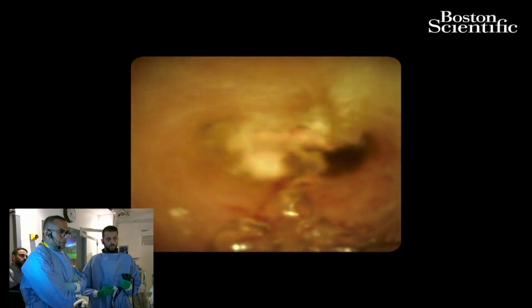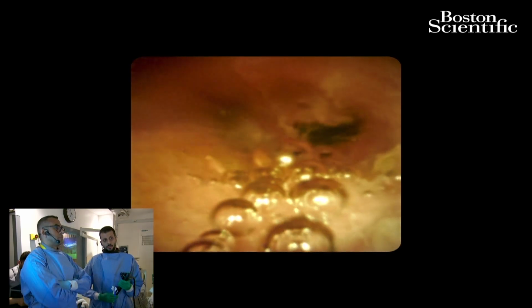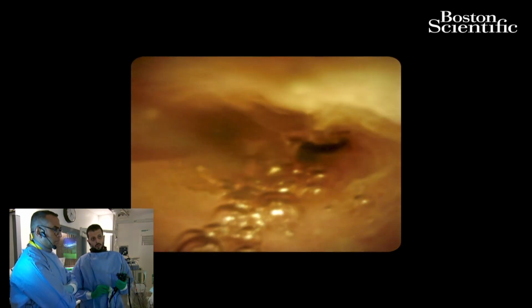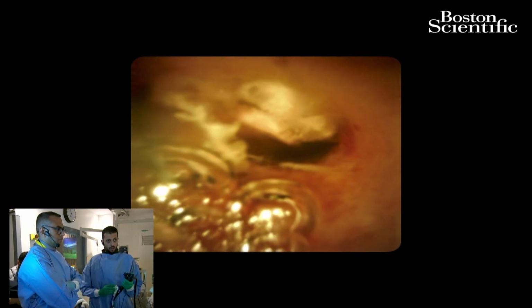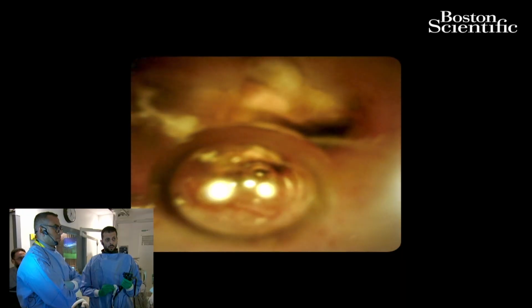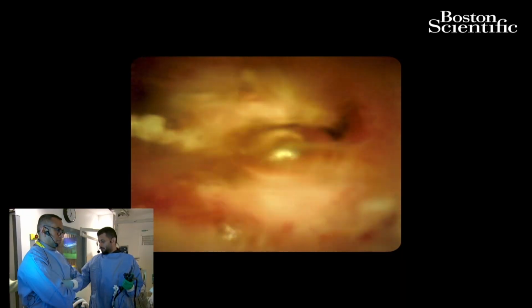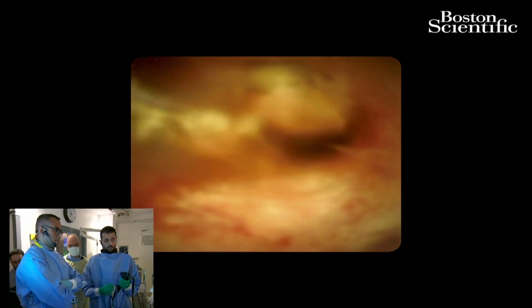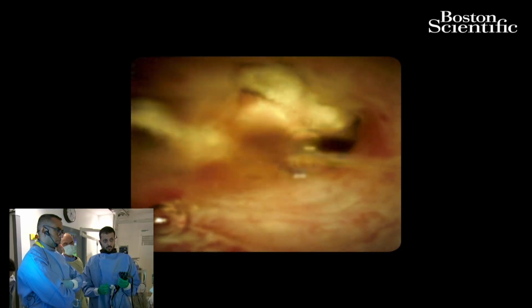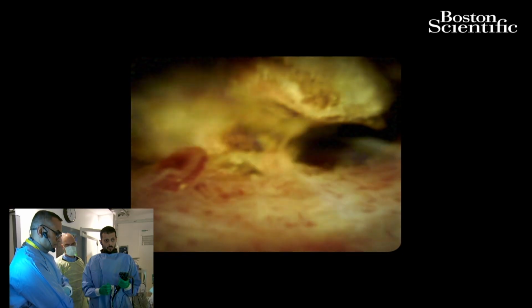Bites, it's more than 6. The studies now say more than 6. The thing is, if this patient presents with a pre-existing stone in the CBD and he has a stricture, it's usually easy to say that's inflammatory. With the study we are conducting with 25 strictures, unfortunately, if you don't have a stone in the CBD before you have a stricture, or like Mirizzi syndrome, most likely this is going to end up being cancer.